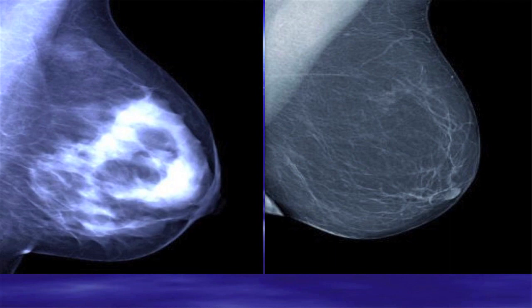This would give you a difference. This is one patient. This is a different patient. This is a fatty breast. This is a heterogeneously dense breast. If there was a 5 millimeter nodule right here, we would see it.